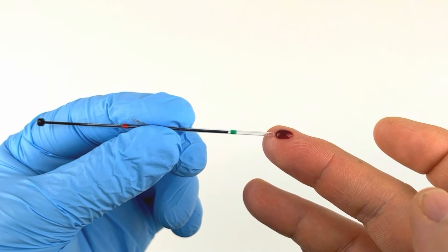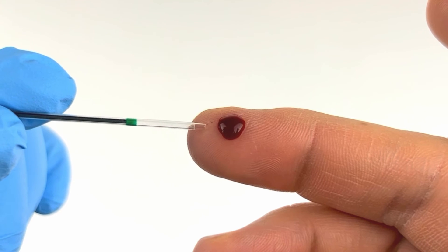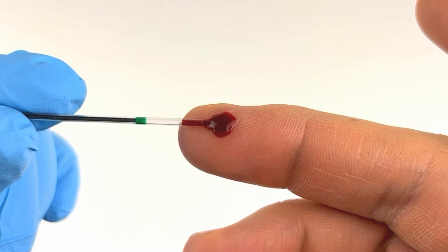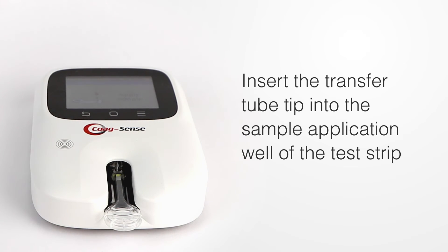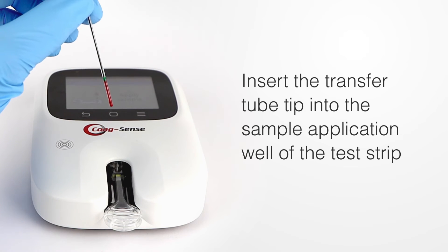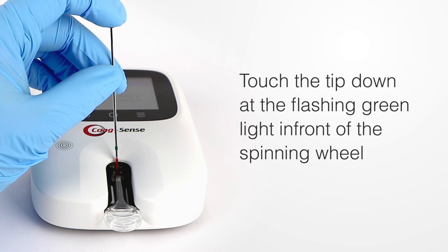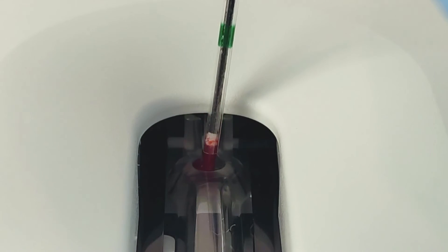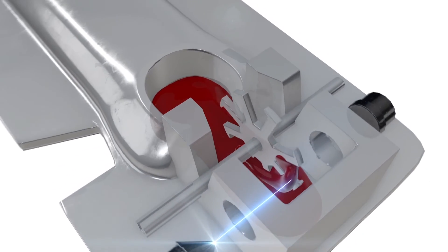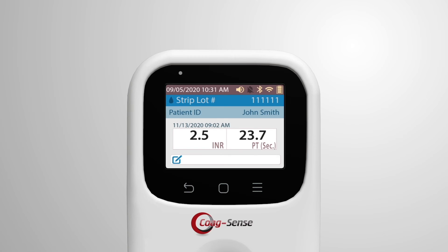Collect the sample using a sample transfer tube. Holding the transfer tube horizontal, touch the tip to the bead of blood and let capillary action fill until the blood flow stops at the green band. Insert the transfer tube tip into the sample application well of the test strip and touch the tip down at the flashing green light in front of the spinning wheel. Push the plunger down to dispense the sample fully. The light should go out and the meter should display 'Testing, please wait.' The testing time is the patient's actual clotting time, as the system produces a true prothrombin time.